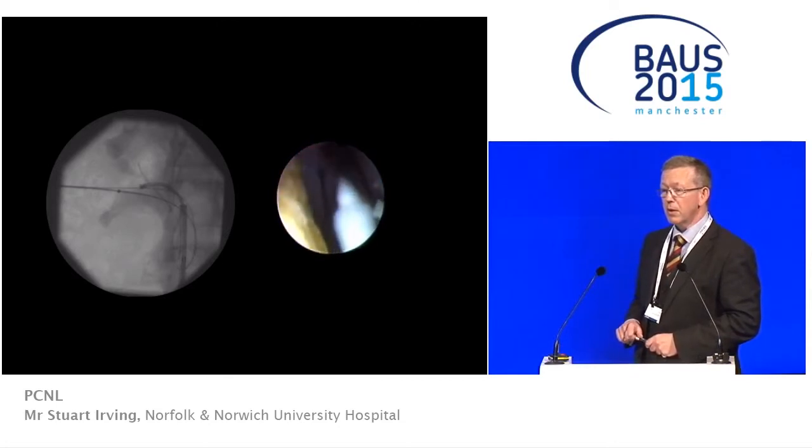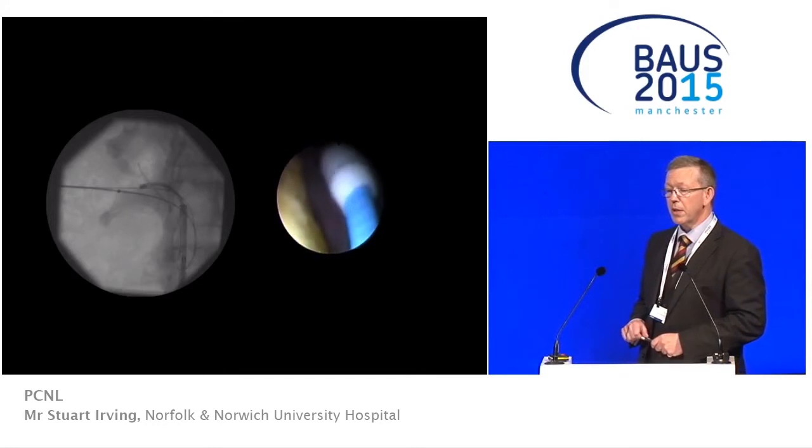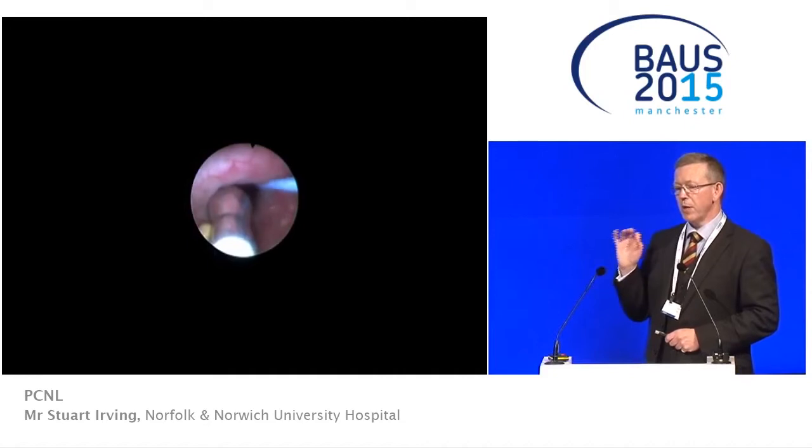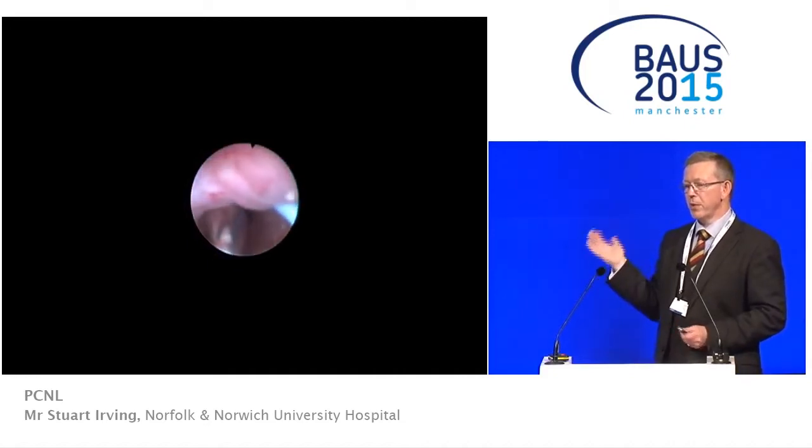Microphone 1, please. Yes, I was wondering if you might have considered grasping the wire, the first wire when it comes through, and pulling it through your sheath, so that way you only need 1 wire. Yeah, we could. The difficulty we had in doing that, we'd like to get one outside the sheath, but there wasn't enough room.